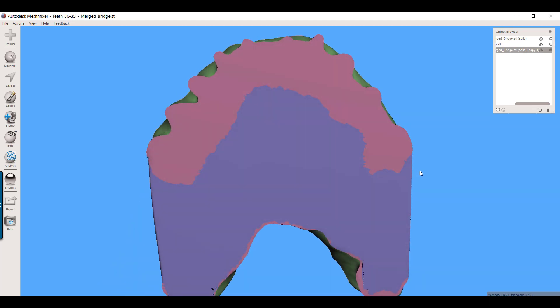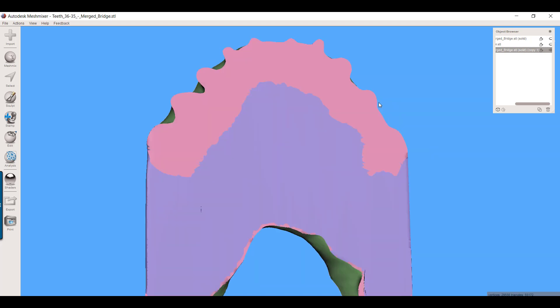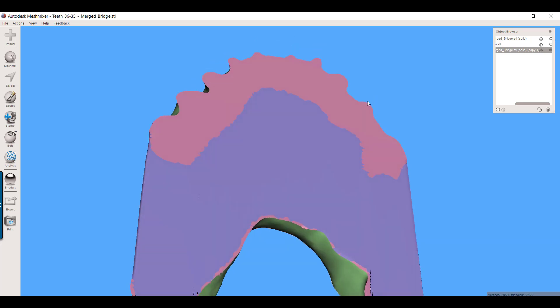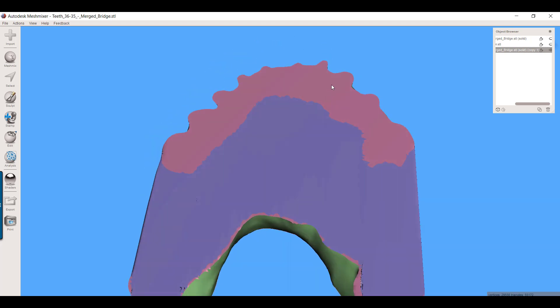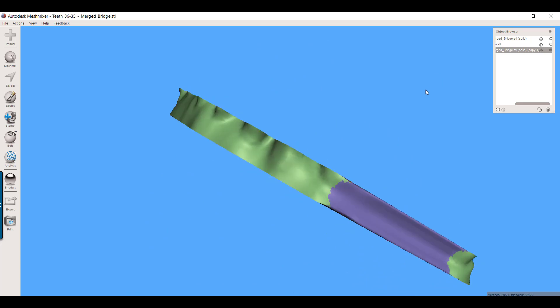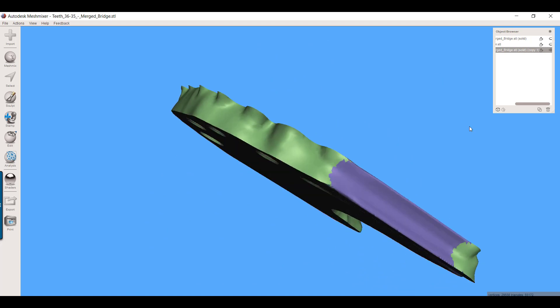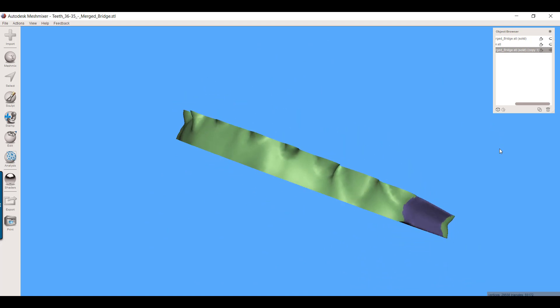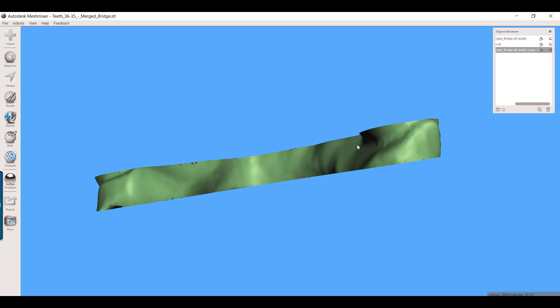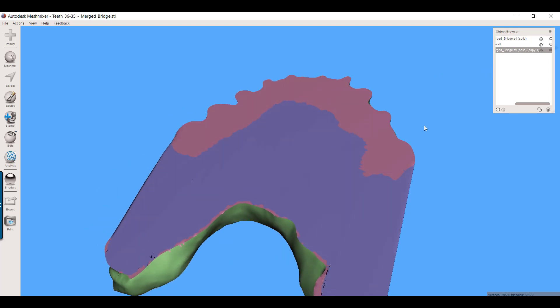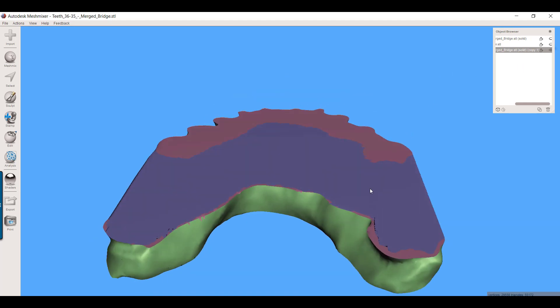And then you're going to have a Trilor piece that will slide right into this temp, bonded in with composite, cement, acrylic, whatever you choose. And then you can encase it on the backside with some salt and pepper acrylic. And the end result is going to be a really indestructible temp. These hold up incredibly well. So much cheaper than milling, very quick to create, as you can see. So I hope you find it useful.